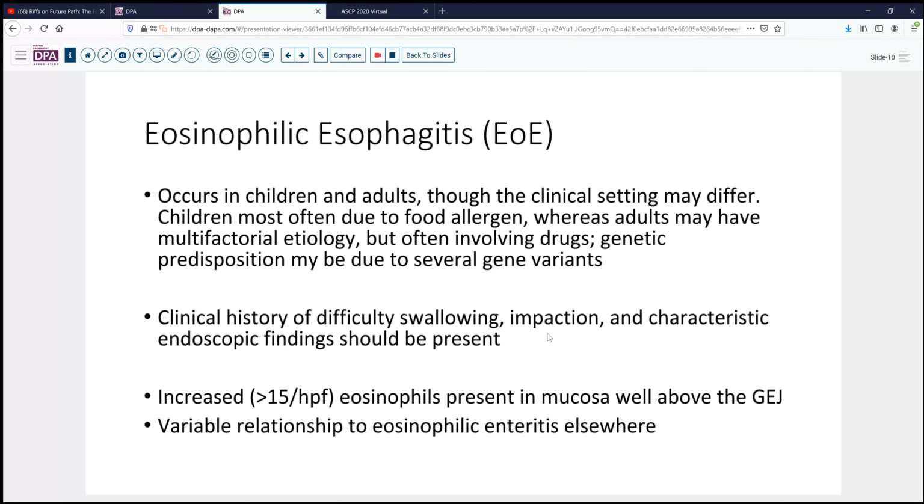Here's another example of eosinophilic gastroenteritis, in this case also associated with eosinophilic esophagitis. And again, we see this very prominent eosinophilic infiltrate in the lamina propria, occasionally present and involving the epithelial compartment with just a few cells within the columnar epithelium, as you see here and here.